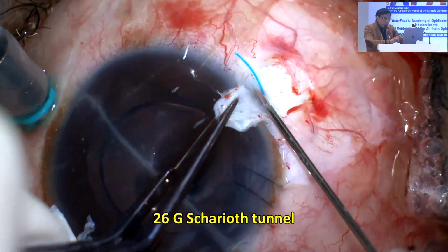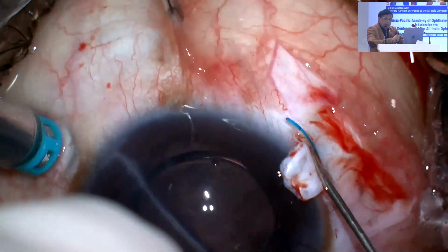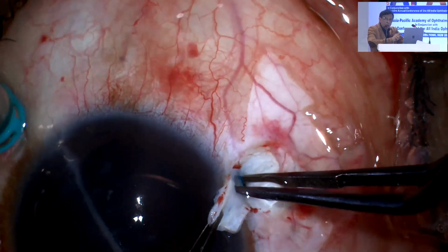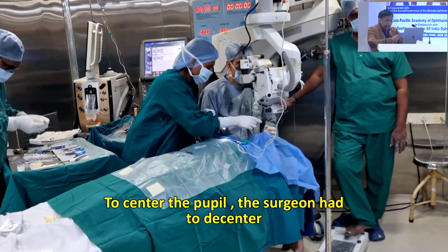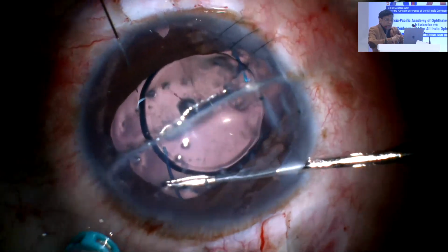The issue here in this case, why I wanted to show you, is not to show only the glued IOL, but now look at the next step which I'm going to show you, and how do you manage this case, and how to avoid the penetrating keratoplasty in this case. So now you see I'm just going to rotate the trolley of the patient so that I can be comfortable.